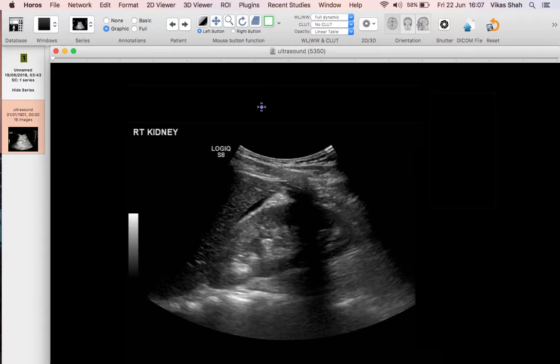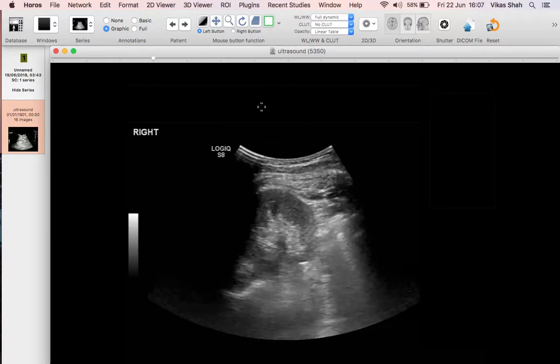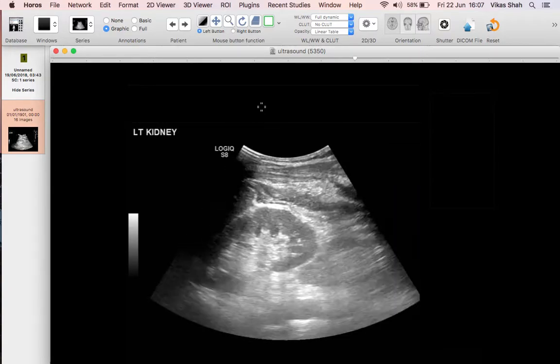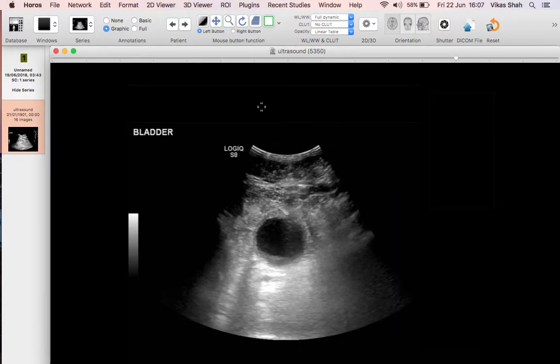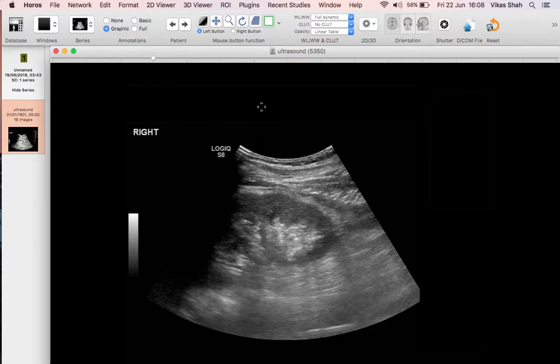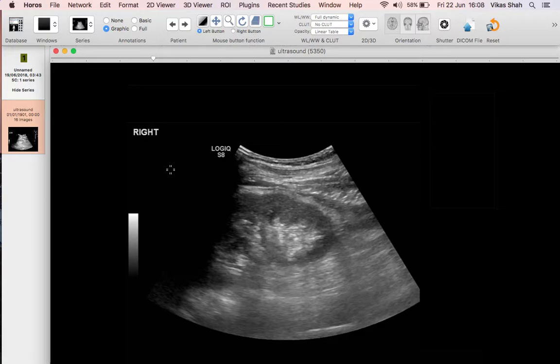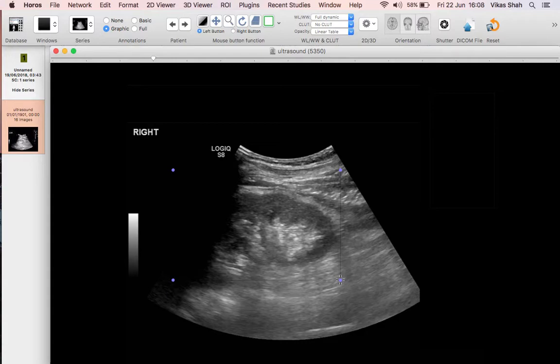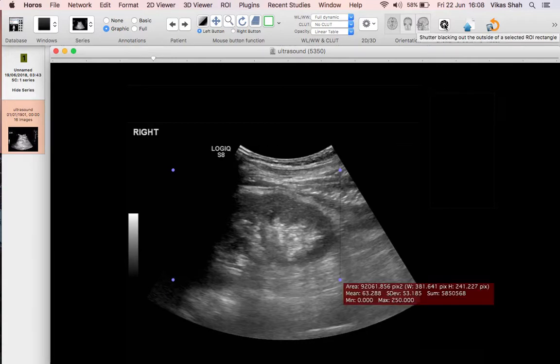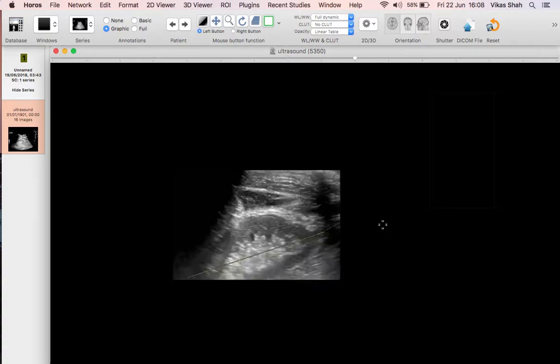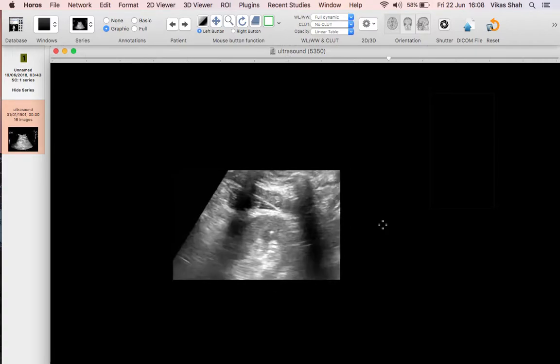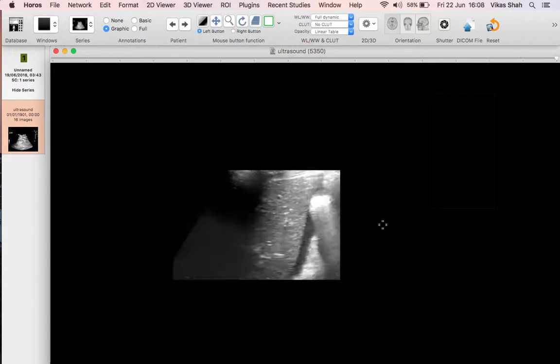Click anywhere outside the ROI to deselect it, and when you scroll through the images you'll see that all of the images have that information redacted. Another technique you can use allows you to effectively crop the images. Select the ROI, choose the part of the image you want to keep by dragging the ROI over it, then click the shutter button. This removes all information outside the ROI box and is applied to all of the images — a useful way of getting rid of unnecessary information.